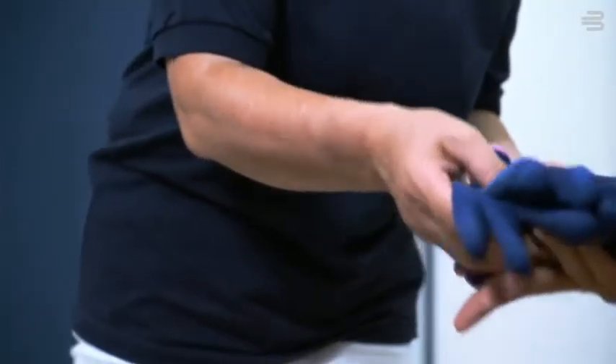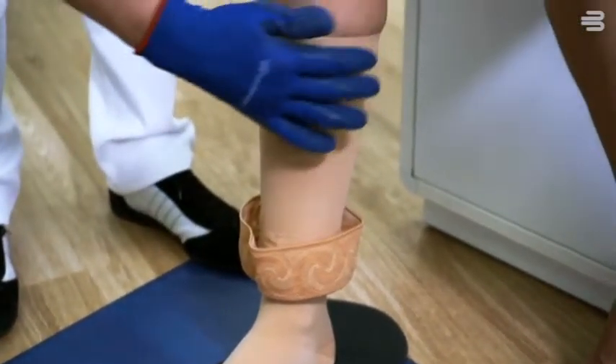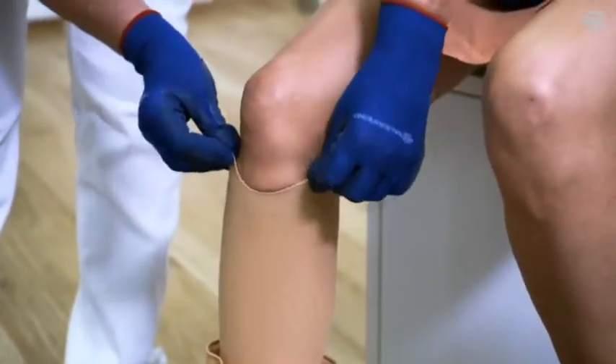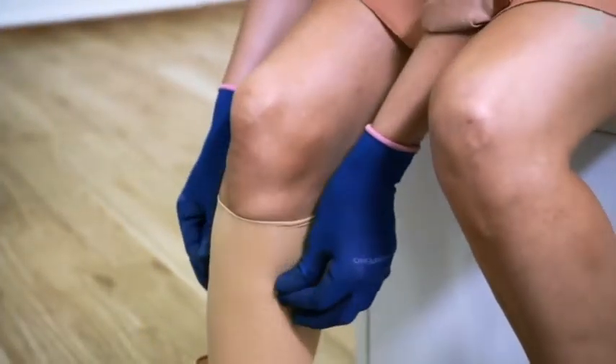Special gloves also help you put on the compression stockings — they make it easier to grip the knit. Now gradually slide the stocking upward, making sure that you stretch and distribute it evenly until there are no creases.